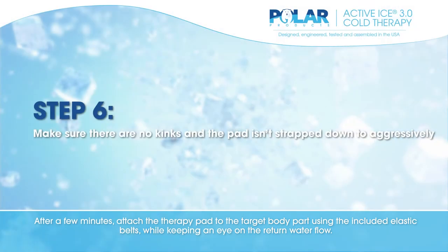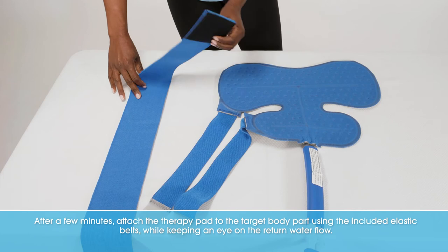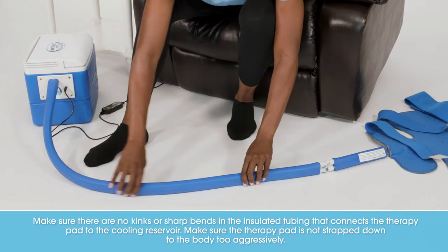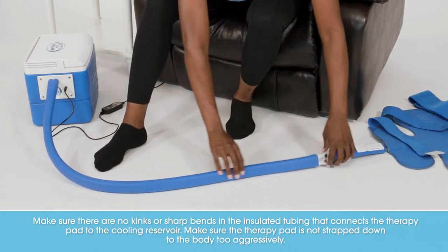After a few minutes, attach the therapy pad to the target body part using the included elastic belts while keeping an eye on the return water flow. Make sure there are no kinks or sharp bends in the insulated tubing that connects the therapy pad to the cooling reservoir.